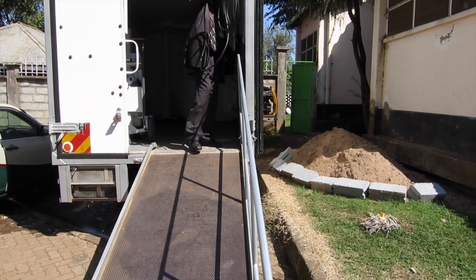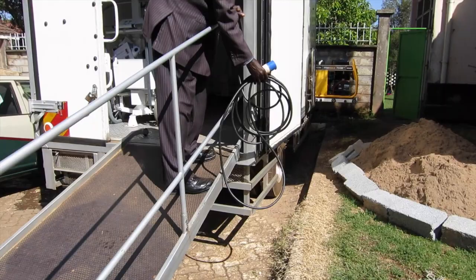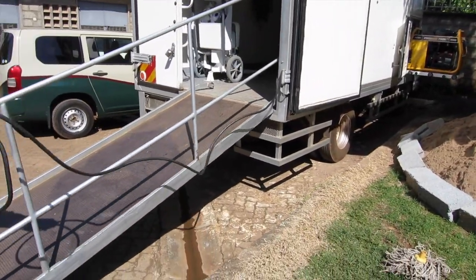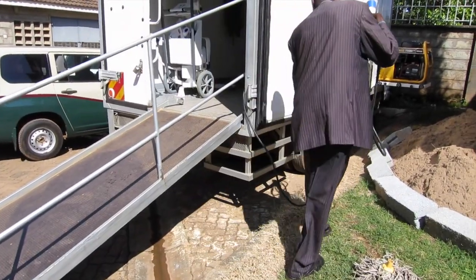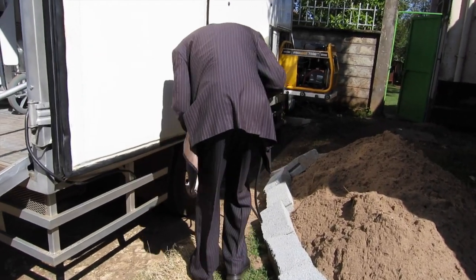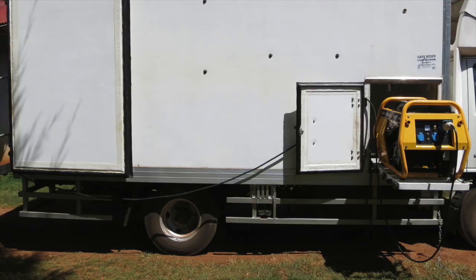Pass the electrical cable down the ramp and along the side of the truck, ensuring that the cable does not touch the ground. You can use pieces along the truck and also the door next to the generator cabin in order to secure the cable and keep it off the ground. Correct positioning of the generator cable is shown here.